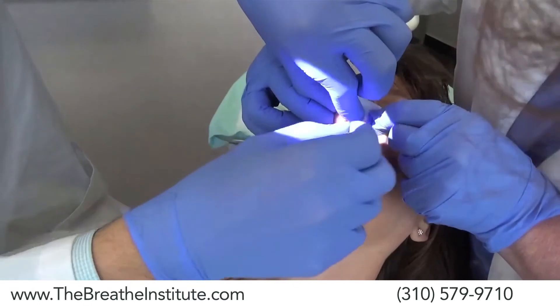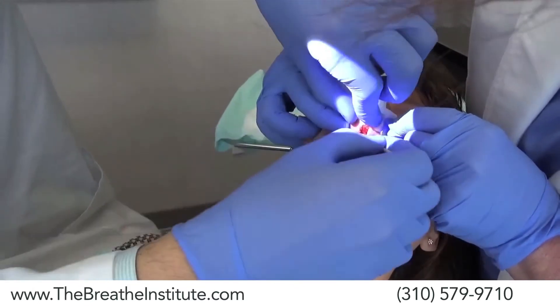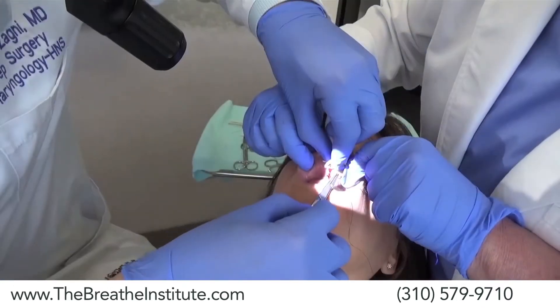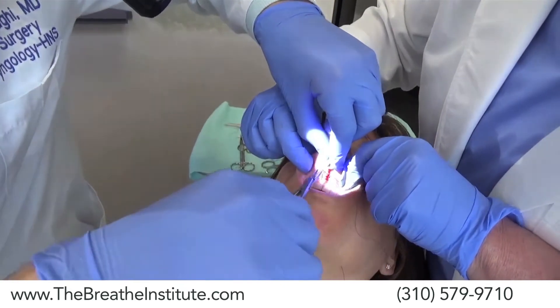The scar tissue from the laser is so bad — a lot of scar tissue. These procedures can help with jaw pain, function, sleep, and allergies. Now let's show you the process from start to finish.